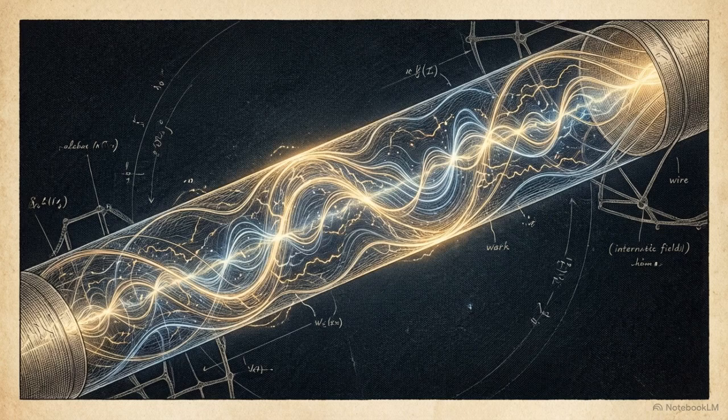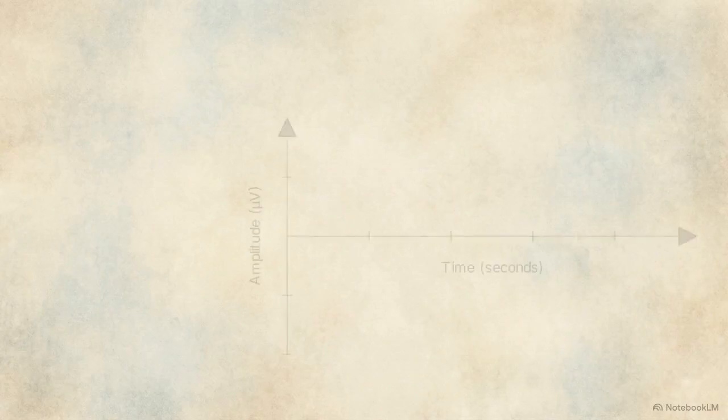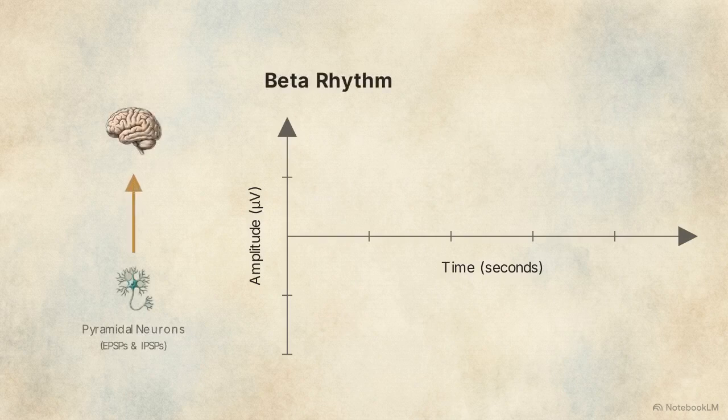The resulting signal is incredibly fragile. The electrical potentials recorded in an EEG range from 0 to just 200 microvolts. The raw continuous waveform displayed on a monitor is simply the algebraic sum of billions of these microscopic cellular conversations happening simultaneously. This diagram illustrates the baseline electrophysiological state of a healthy, awake patient.